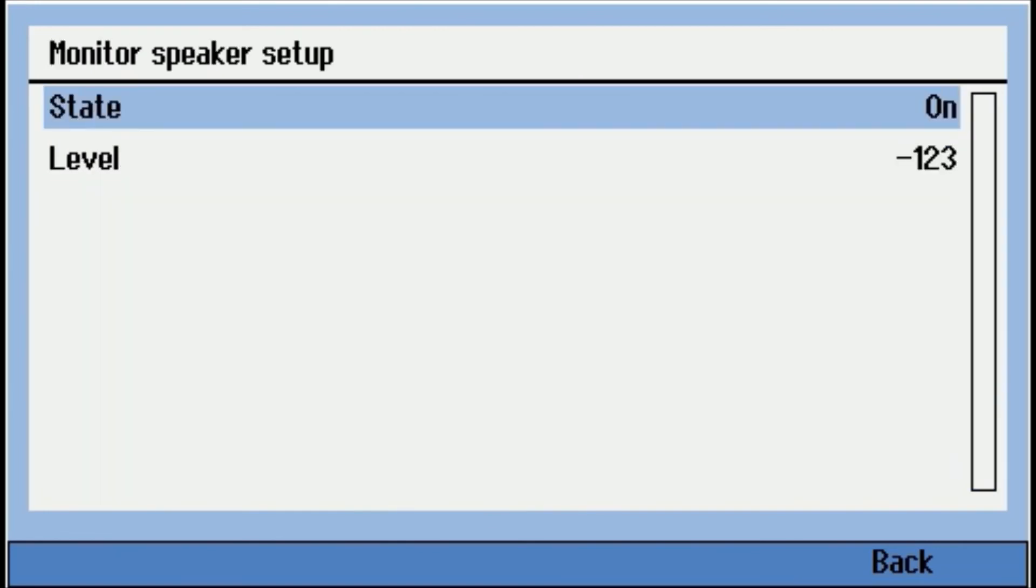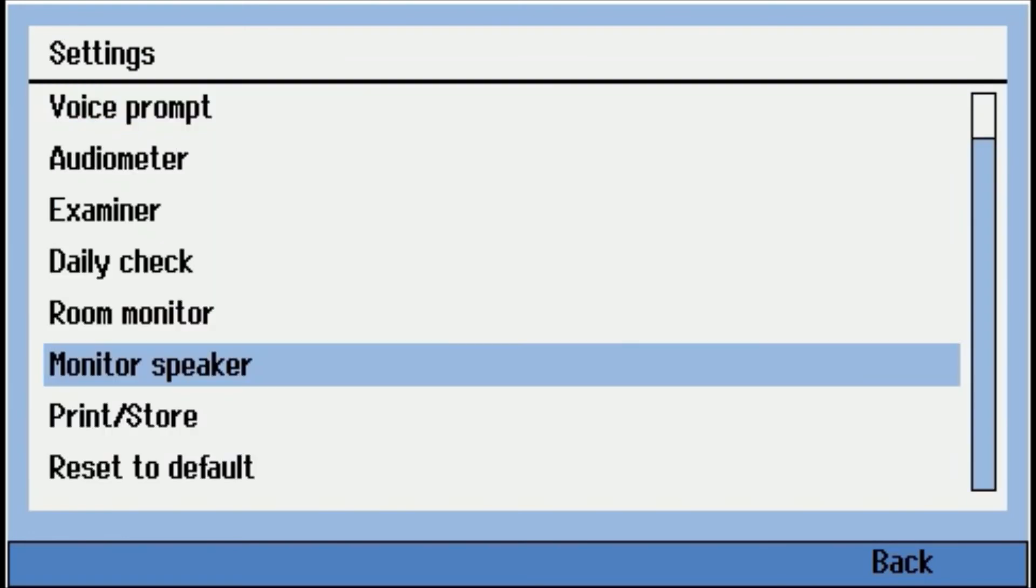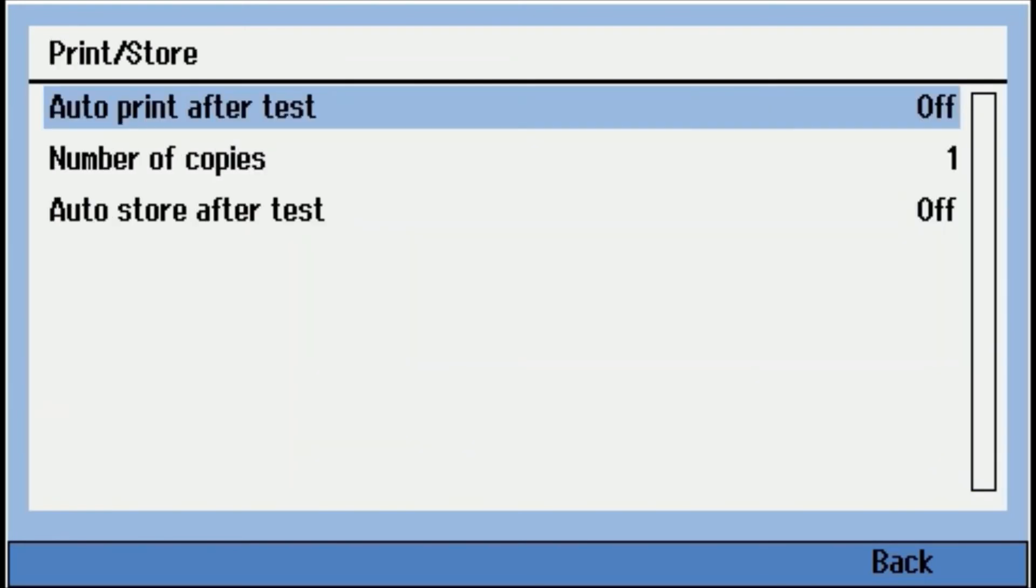Monitor speaker. So there's an internal microphone. So you'll be able to talk to the person in the booth. It's pretty much just an on-off. Print/store. So this will let you automatically print a test result or store it internally to the database or kind of a mixture of the two. The RA 360 will hold 500 records internally.